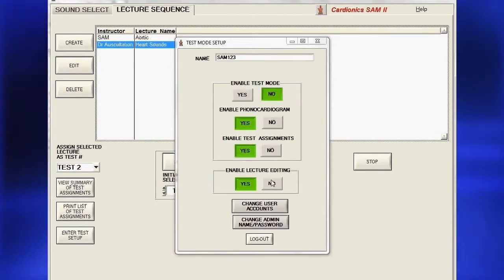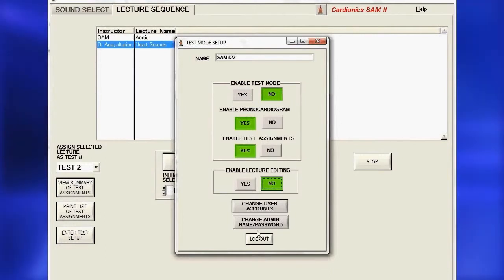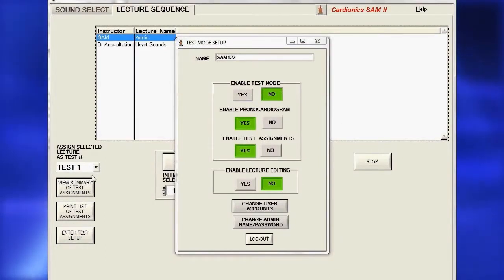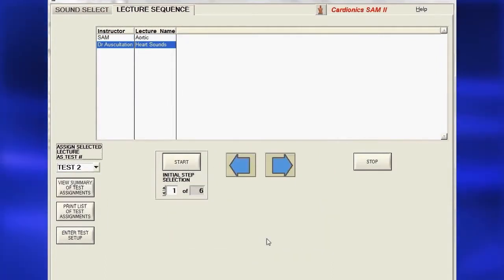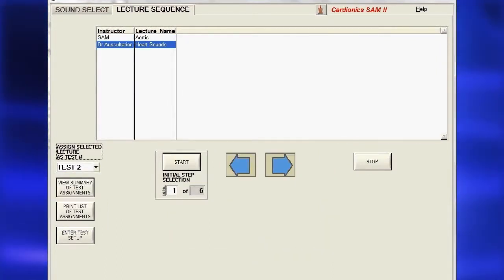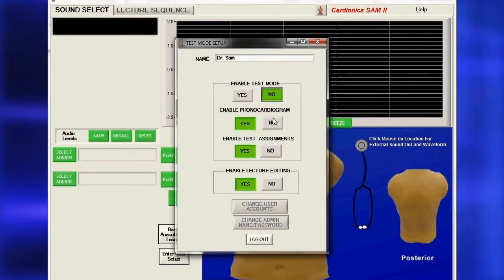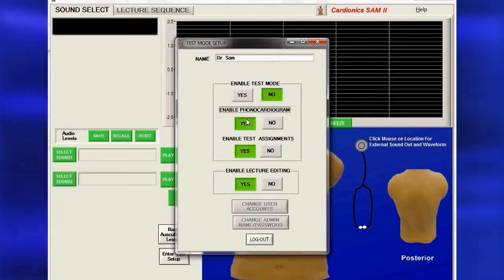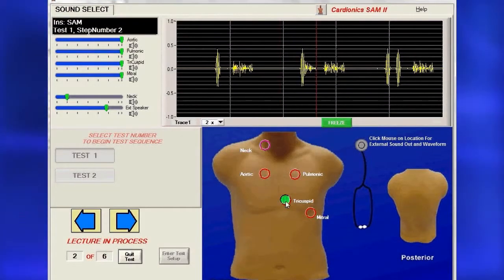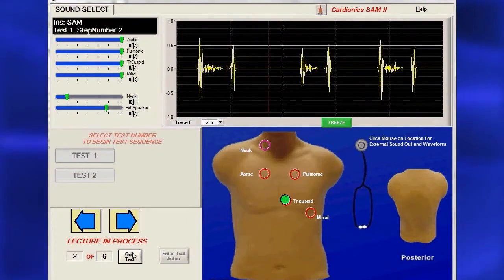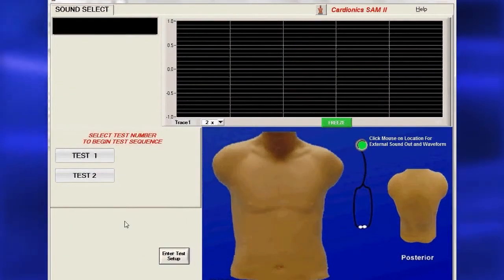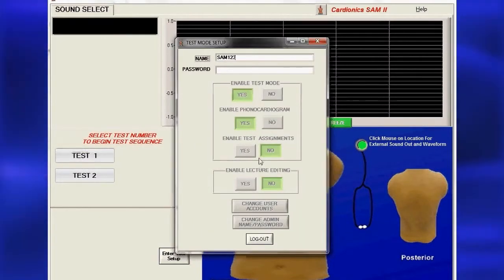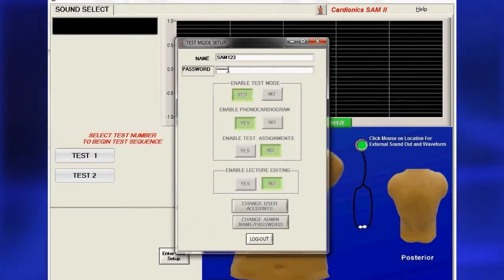If a lecture is to be used as a test, it must be assigned a test number. To create a test, select a lecture sequence, instructor, and test number, then click Start. Next, choose whether to display a phonocardiogram on the test. To quit the test at any time, click Quit Test. When finished, you will still be in test mode, so you must return to the Test Setup page and enter your name to log out.